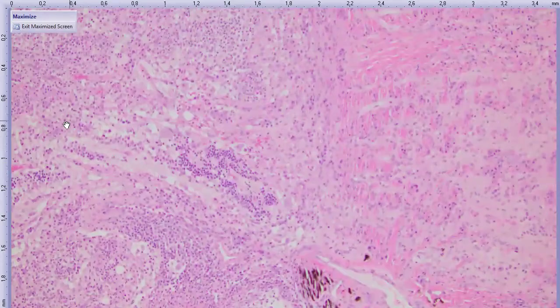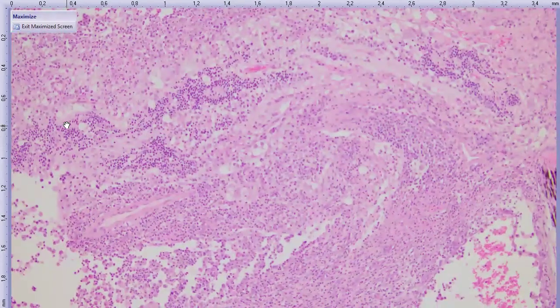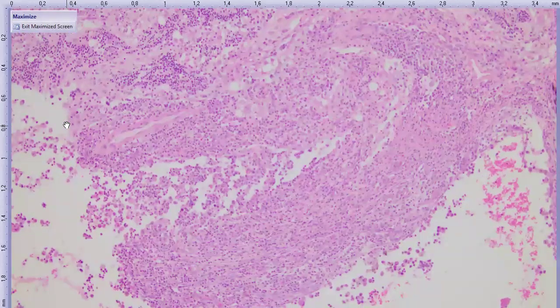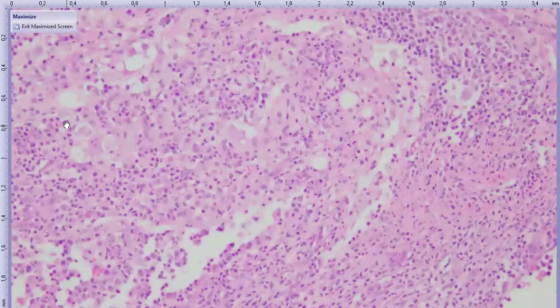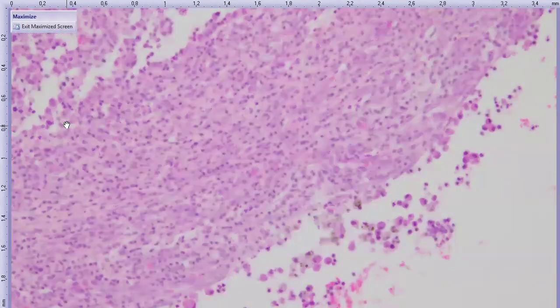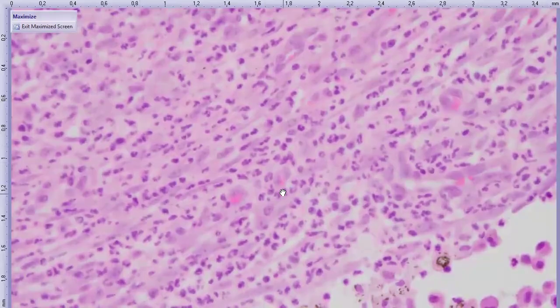And if you follow the vessels, you might find the retina. So we're following the vessels here, a large vessel right there. You can see already that the retina, subretinal space, vitreous, and the choroid are markedly infiltrated by inflammatory cells. Not only infiltrated, the retina is actually effaced. And right away, we've got lots of neutrophils, lots of macrophages in the background, some neovascular profiles.